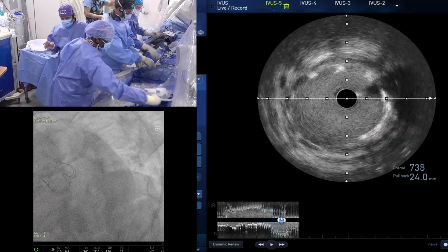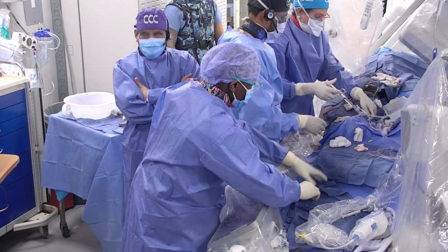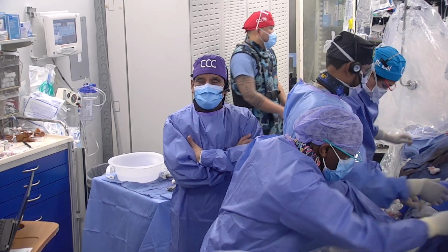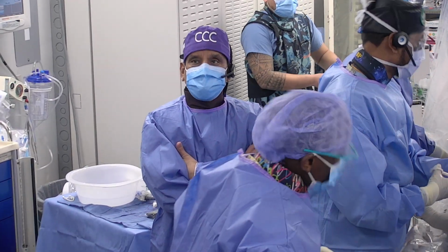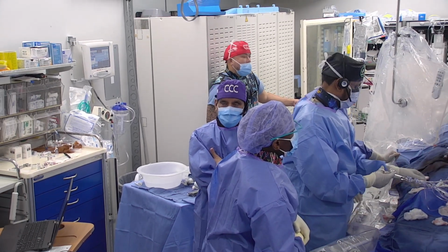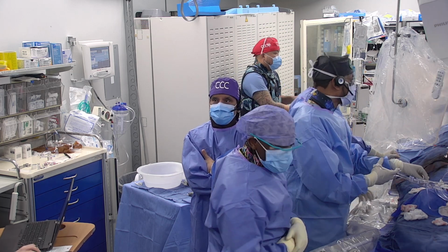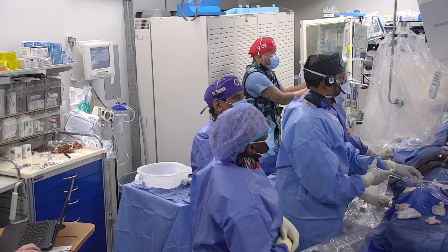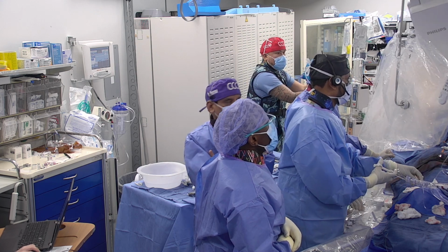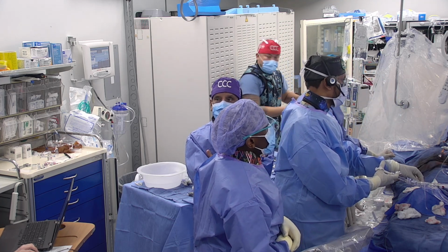At this level, a two-stent approach is always better. You know, there is a recent paper from Korea, from all the trials up to 10-year follow-up of the left main, IRIS-MAIN, PRECOMBAT and so on, and also the DEFINITION trial, all showed that the two-stent approach, of course, has a slightly higher TLR, but from a mortality point of view, at 10 years it did better. It was the only one associated with a lower mortality with a two-stent approach. In these cases, clearly using a two-stent approach, I am still a believer. Some people say, well, we go with the EBC approach with a stepwise provisional, but I think the two-stent approach with the lesion 0,1,1 or 1,1,1 is the right approach.